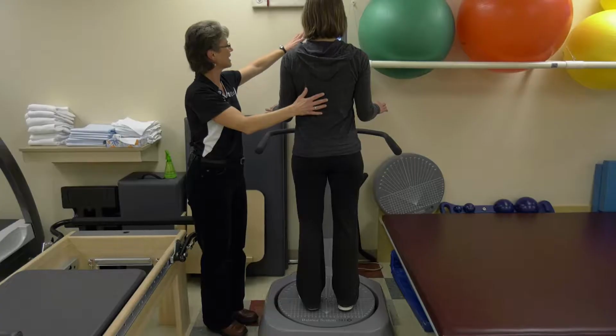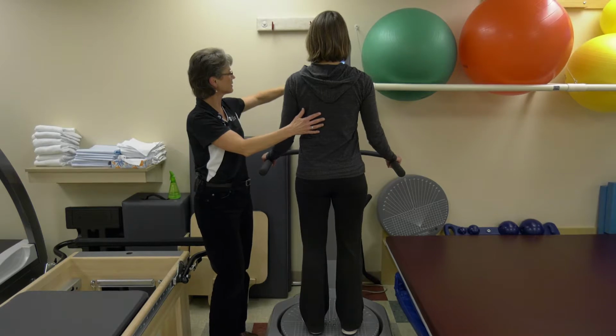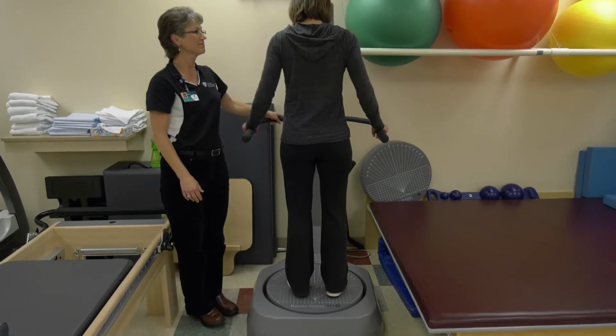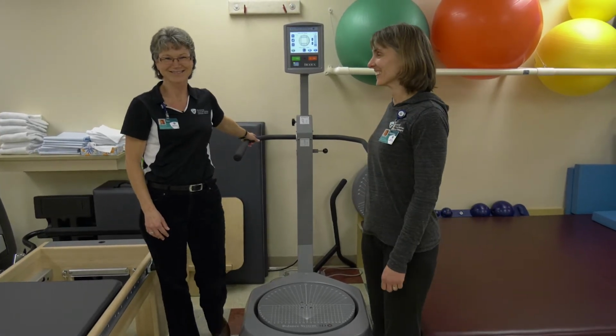Okay. So it doesn't take long for people to get tired. So then she can hold on to the bars, and I'm going to stop it. And again, this becomes very stable then. And then she can hop off and be done with that. And be thankful she's on solid ground once again.